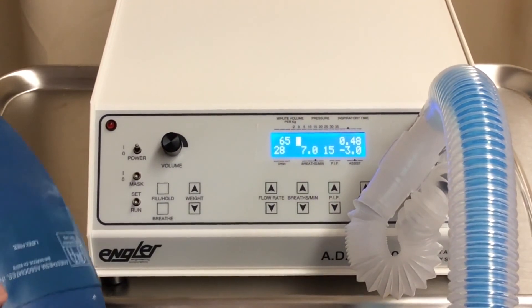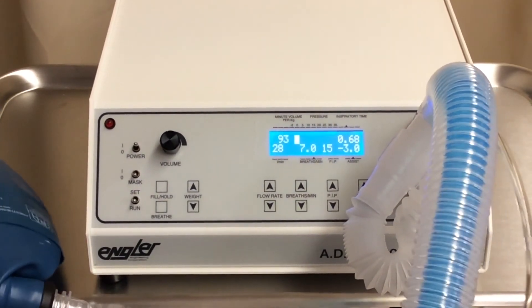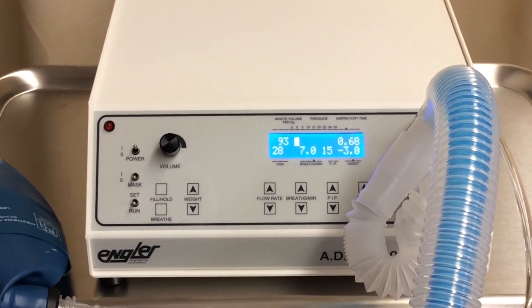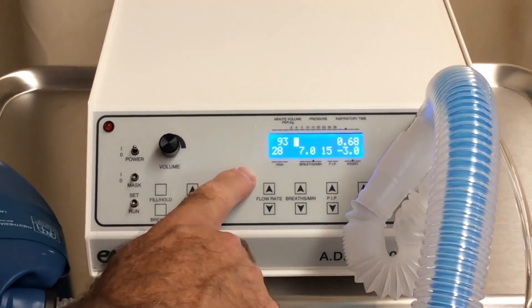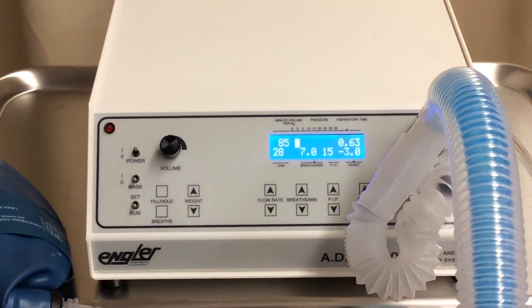That concludes our introduction of the ADS-2000. Again, keep in mind the changes that we came up with are the backlit blue display and the gas sampling hose.